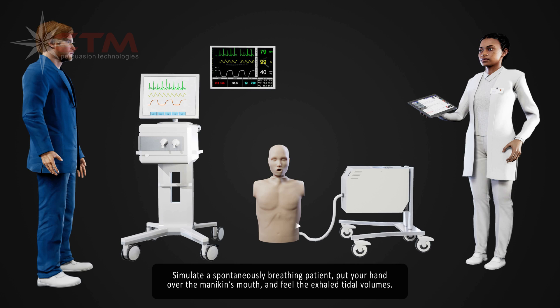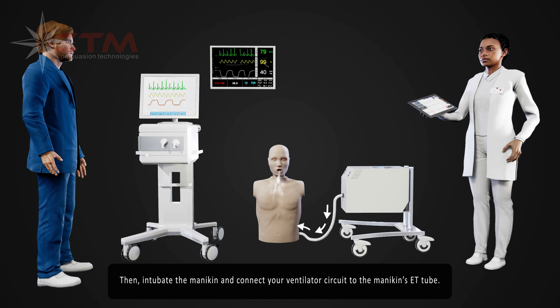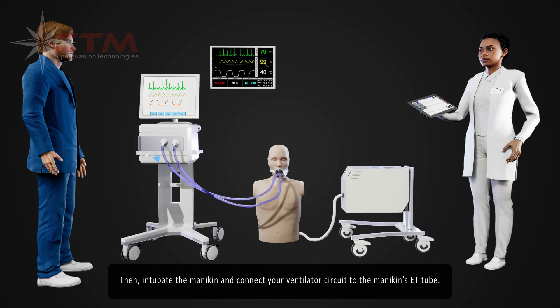Simulate a spontaneously breathing patient — put your hand over the mannequin's mouth and feel the exhaled tidal volumes. Then intubate the mannequin and connect your ventilator circuit to the mannequin's ET tube.